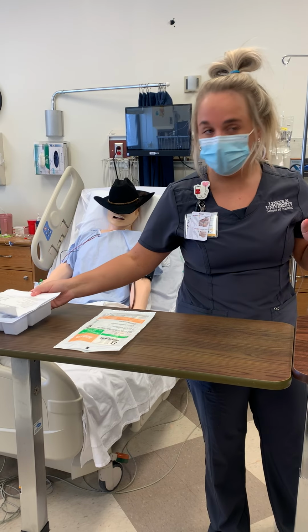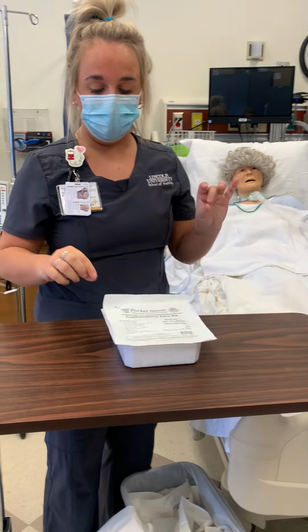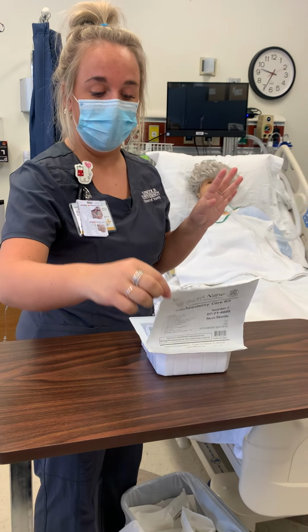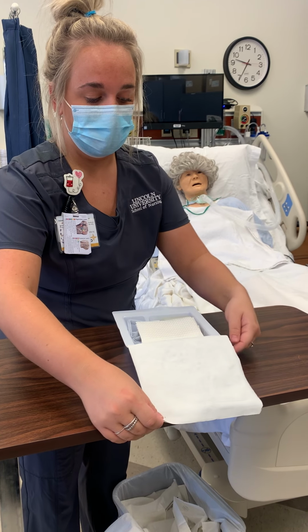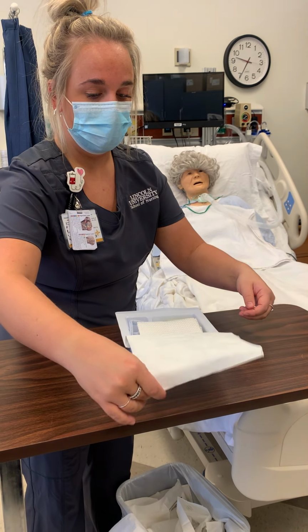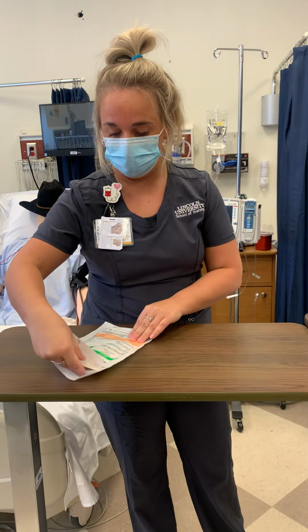All right, so I'm going to make sure I get my trach kit. And I'm going to go ahead and just open the top so it's ready for me after I have my sterile gloves on. Okay, then I can go ahead and put on my sterile gloves. So I do hand hygiene again.